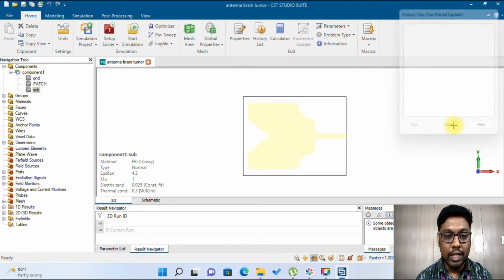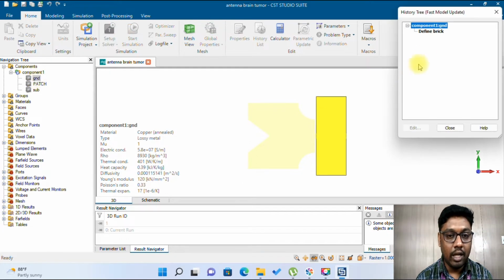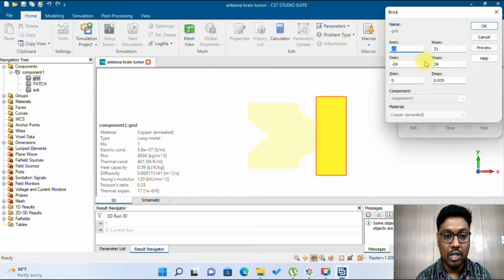Coming to the other two layers, one is the ground layer. Initially I created the full ground, and I did a parametric sweep for the ground length. The length I have given here is around 1/3 of the actual surface area of this microstrip antenna. The length of the antenna is kept similar to the substrate, that is 48, and the ground layer material is copper with a thickness of 0.035 mm. The width of this ground is around 18, which gives the maximum performance. So I have done the parametric sweep.